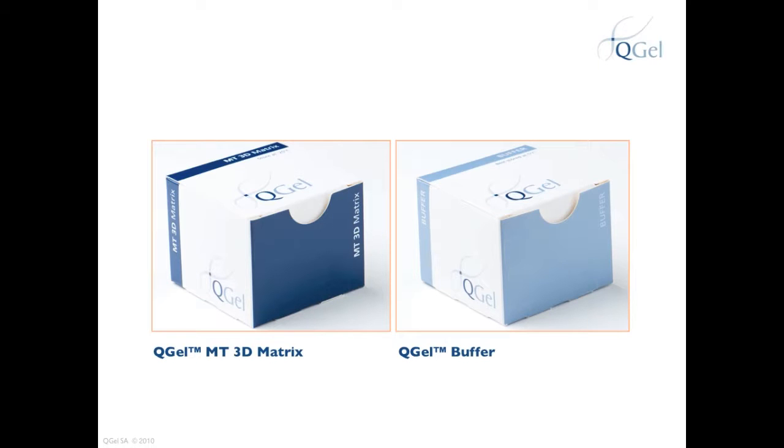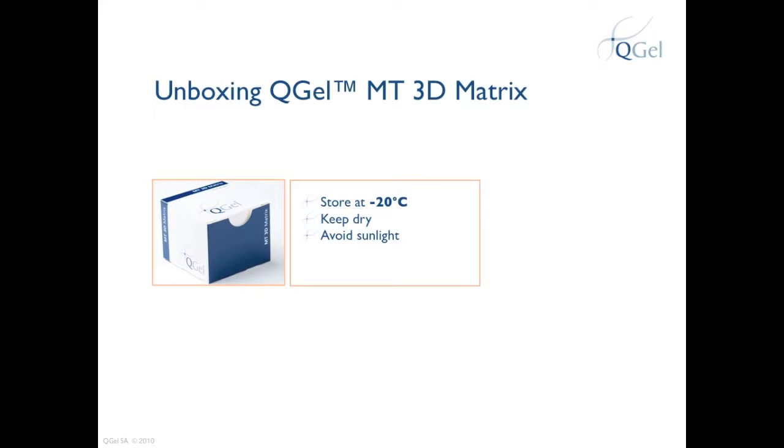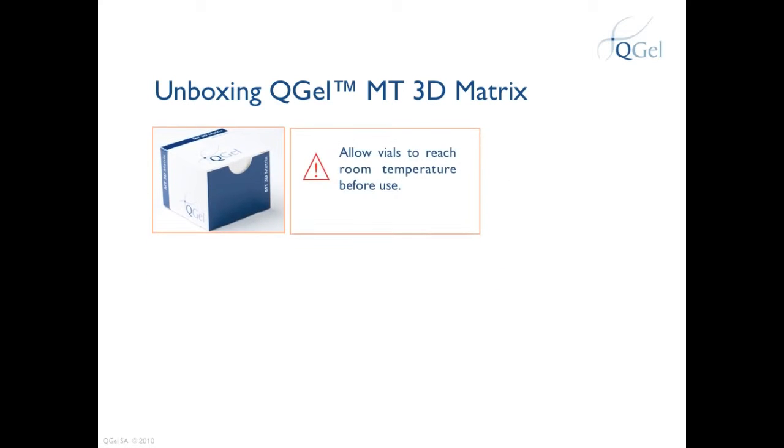When you receive QGEL MT3D Matrix, store the box at minus 20 degrees Celsius in a dry, dark place. A temperature-controlled freezer is recommended for storage of QGEL MT3D Matrix. When you decide to perform your experiment, allow the vials to reach room temperature before opening them to conduct your experiment.